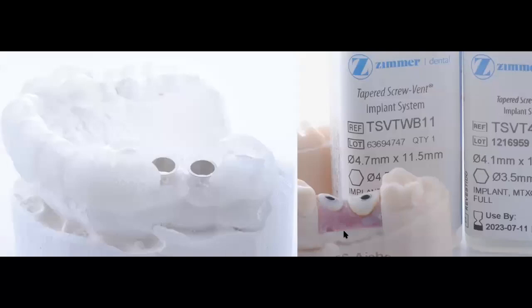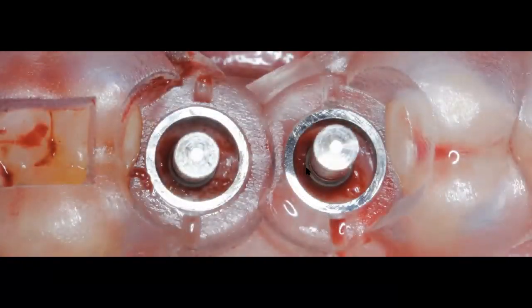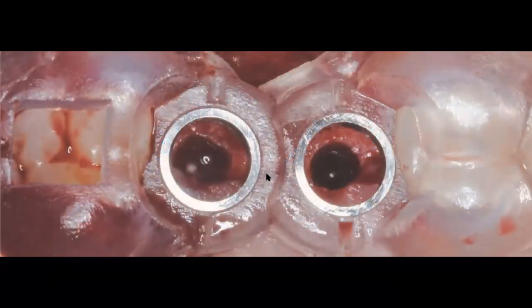So not only was I going to be able to use my guide to place my implants, but then I was going to be able to insert these custom healing abutments within the implants and get the correct emergence profile. All this was planned again from the get-go through that software. And now you can see this intraorally. These are my bleeding points. You can see my paralleling pins, and this is after my incision and a flap, and you can see the location of the implants right where we had planned.